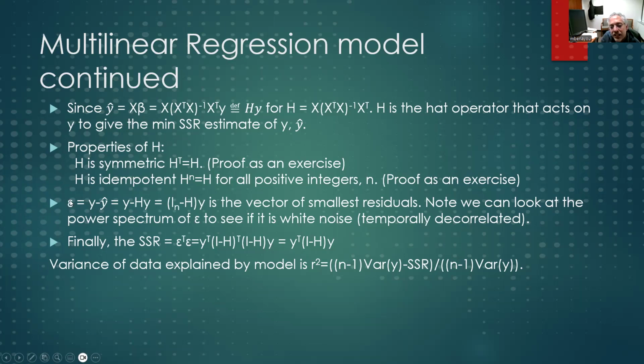So the next thing I would say is, if you wanted to know the error, how far off our prediction is, you would look at the bold signal minus our best prediction. And this error should be small if the voxel was part of the task, but could be really big if it's a voxel that had nothing to do with the task.